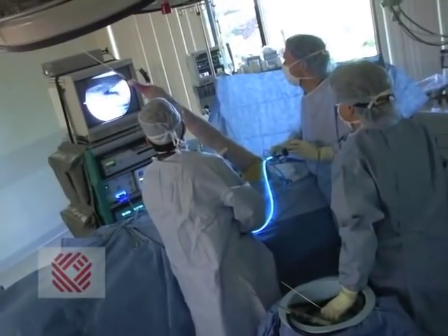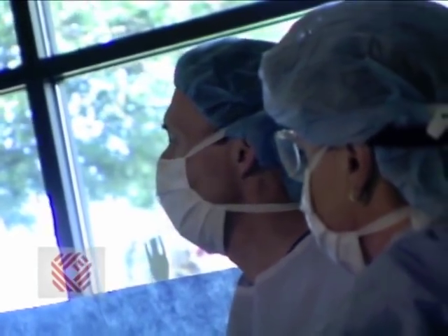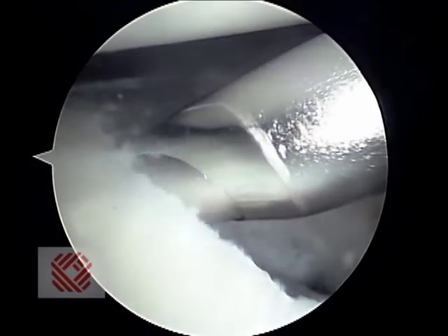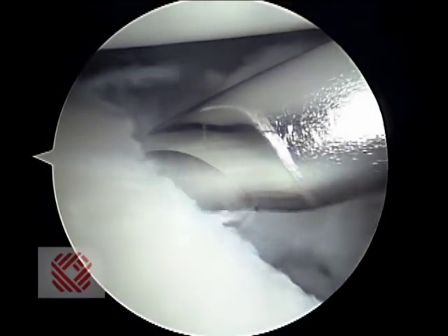Our patient is a 27-year-old male who injured himself at work lifting a heavy object and dislocated his shoulder. He has had chronic instability — his ligament has peeled off and retracted against the glenoid about a centimeter or more, which is about half an inch. That's indicative of chronic instability rather than an acute injury. A fresh tear, like from a wrestler or football player, would be a lot less fibrotic, with the tissue sitting along the edge rather than retracted medial to the glenoid.